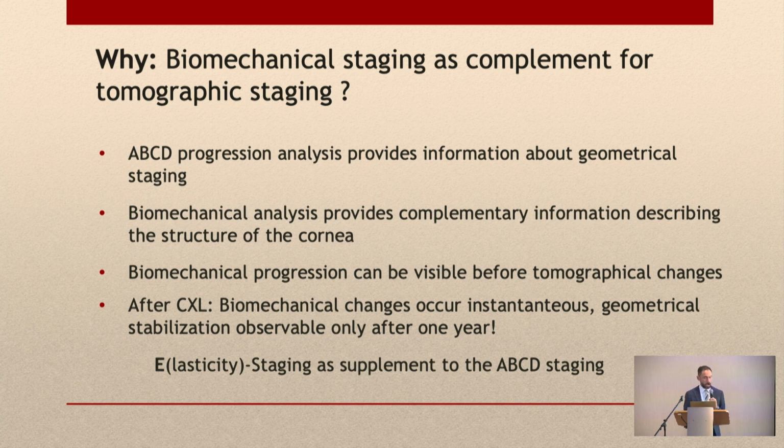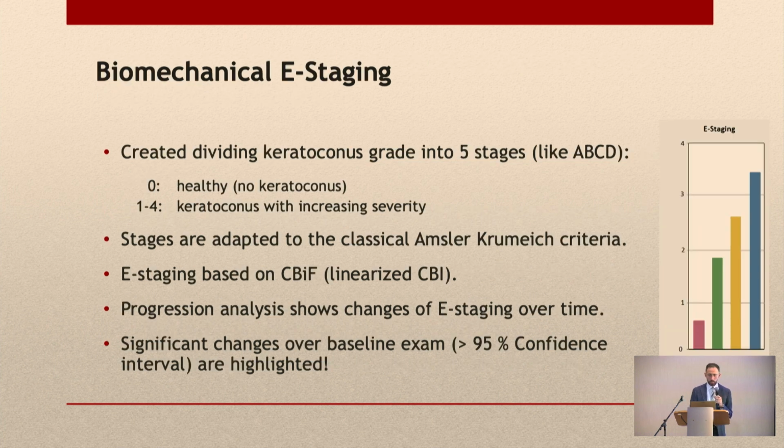So this is a study in which we collaborated with Hamburg University. None of them is here, so they asked me to show this study in which I was a co-author. And they created a new value that is called the E-ABCDE, which makes sense, and it's also elasticity, so it's easy to remember, and was somehow created with our work.